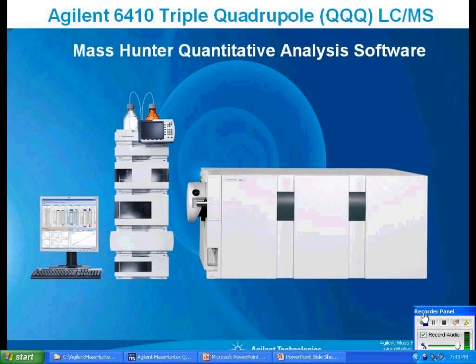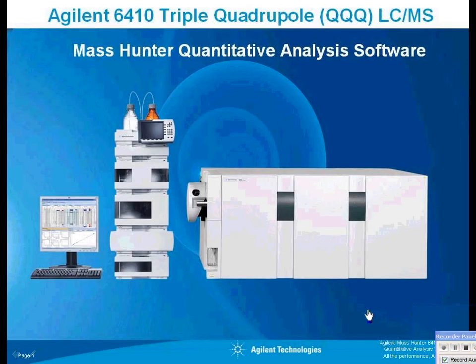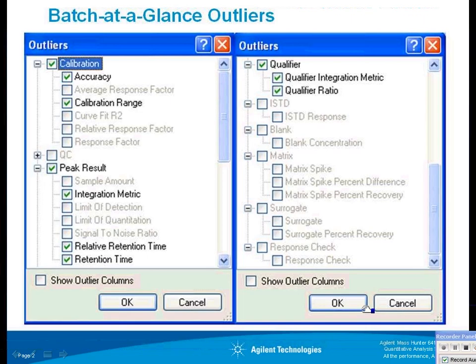I'd like to talk about the use of outliers in Batch at a Glance. Outliers is a tremendously productive feature because it allows you to set limits on your samples and the compounds in those samples, and discover quickly whether there's an issue in terms of the limits that are set.